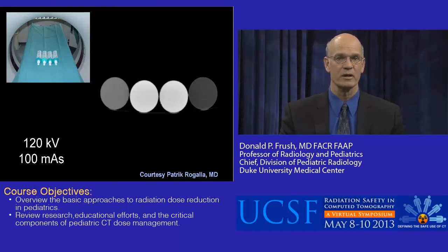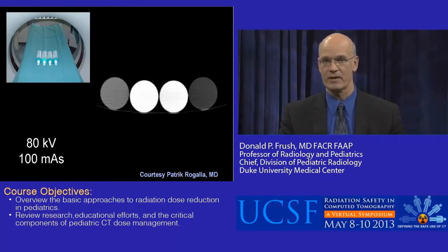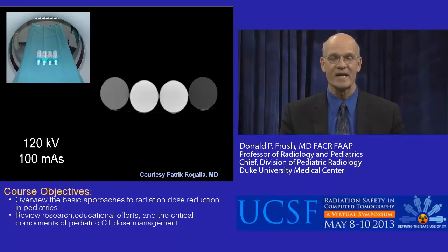Look what happens to image contrast. So the contrast goes up. The noise also goes up. That is an effect of decreasing the kV. But look how much more we gain by going down in kV in terms of going up in contrast. If we go up in kVp, watch the 2 center cylinders there, see our contrast goes down. We have a less noisy image, but that is at the expense of decreased contrast.